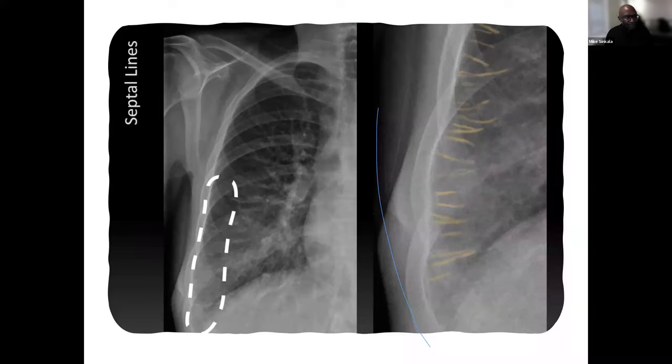So alveolar edema largely is secondary to heart failure. But when you see septal lines like this, interstitial edema with a linear kind of involvement in a patient with no heart conditions, one would be worried about lymphangitis carcinomatosa, or any other type of cancer we need to look at. That's why I said there are different types of lung conditions. It is either affecting the lung parenchyma, or it is interstitial. So interstitial conditions and parenchymal conditions are totally different.